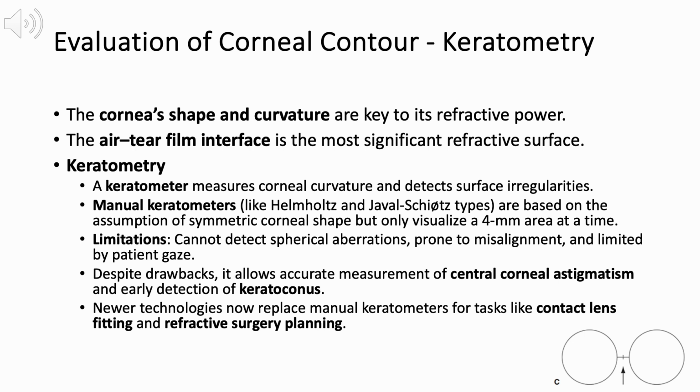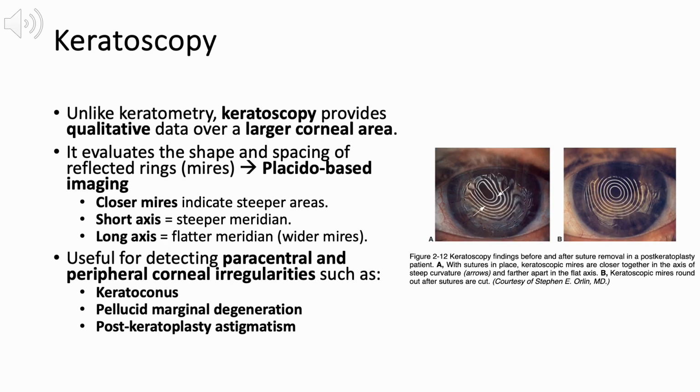That said, newer imaging technologies are increasingly replacing manual keratometers, especially in contact lens fitting and refractive surgery planning, where more comprehensive topographic and tomographic data are needed. Keratoscopy differs from keratometry by providing qualitative data across a larger corneal area.